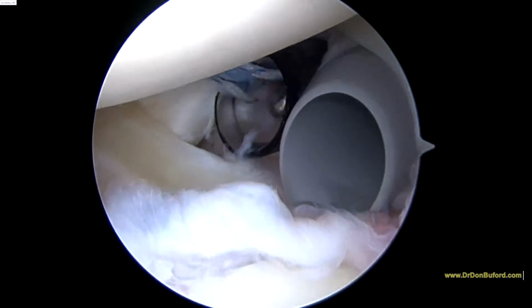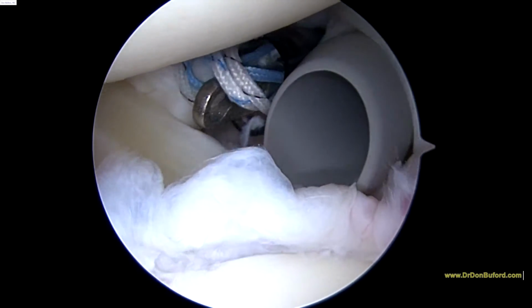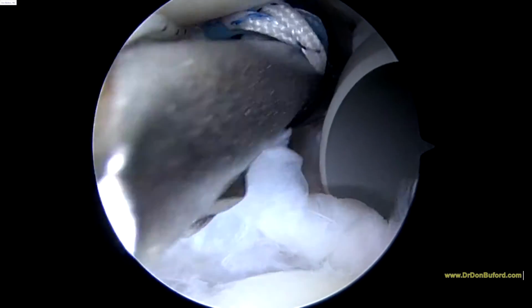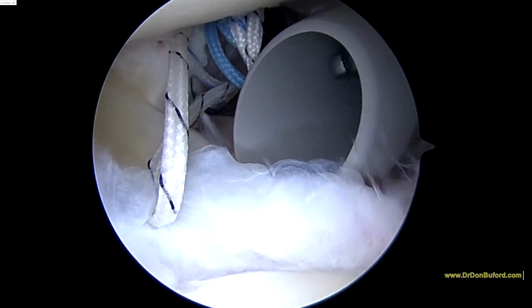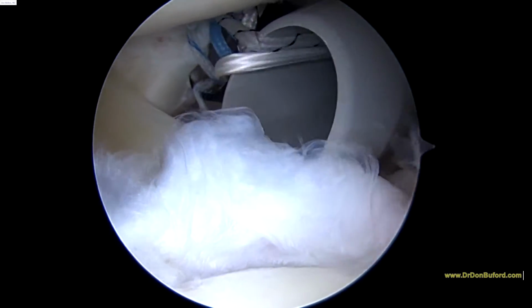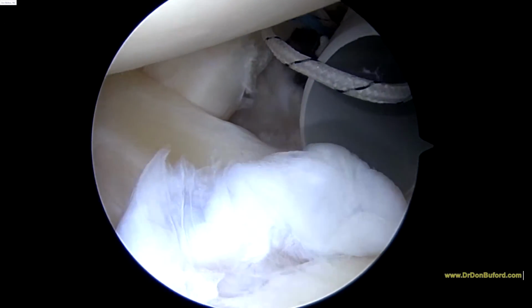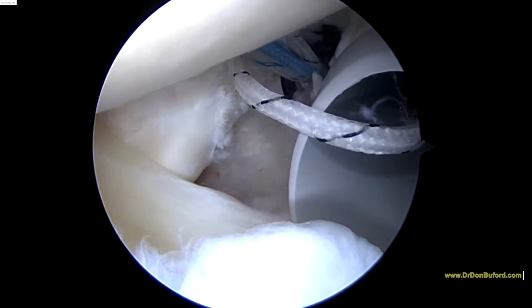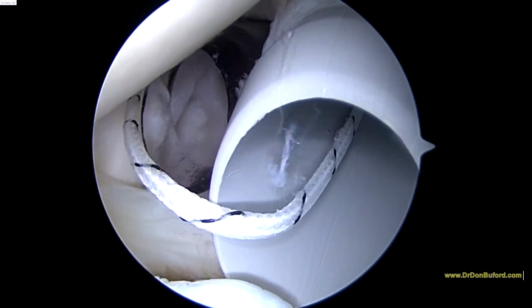I'm just trying to decide which one I want first. That way, we'll take the black and white striped suture first. So that's going to come out right here. Okay? Pull tight on these others. And so the next step will be to pass a stitch through the torn edge of the subscap. And the other sutures outside the cannula, so we won't have any problems with our sutures getting crossed or tangled.